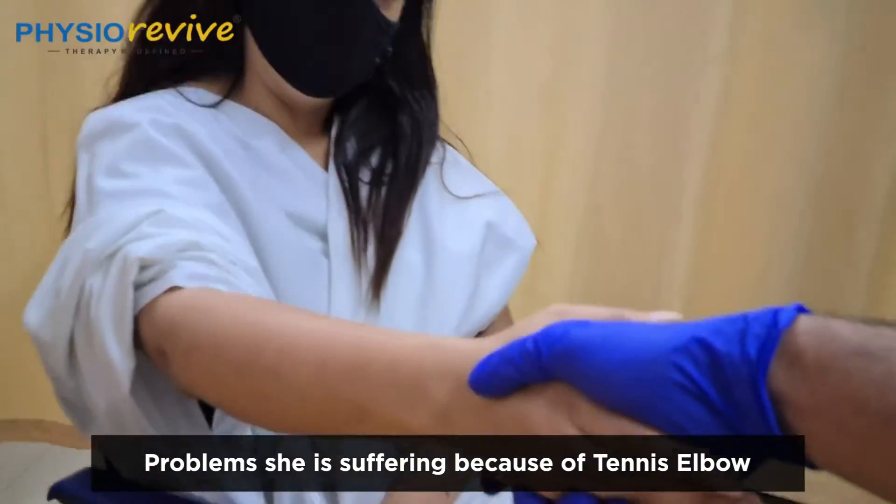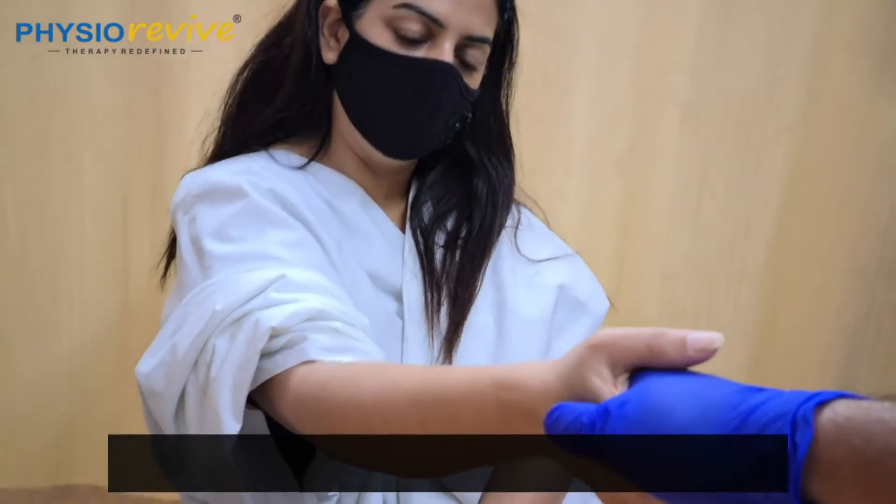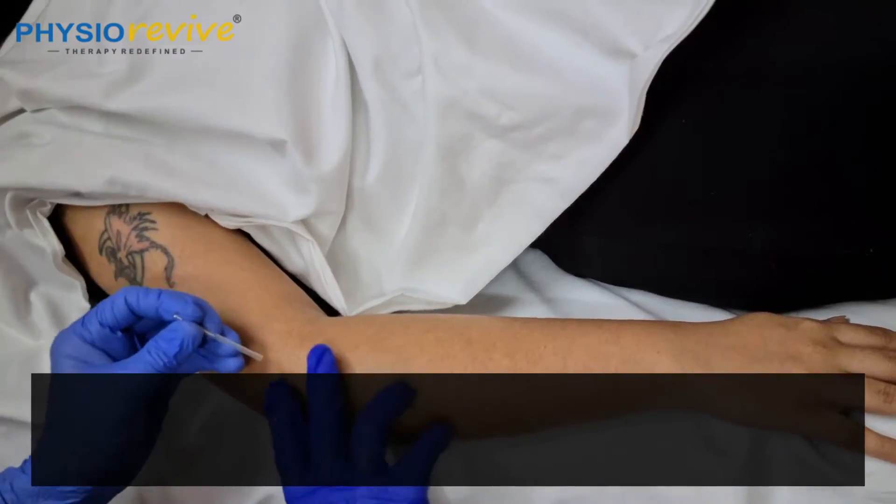So let's check this movement. Is this painful? Yeah, painful. Can it be painful? Not at all.